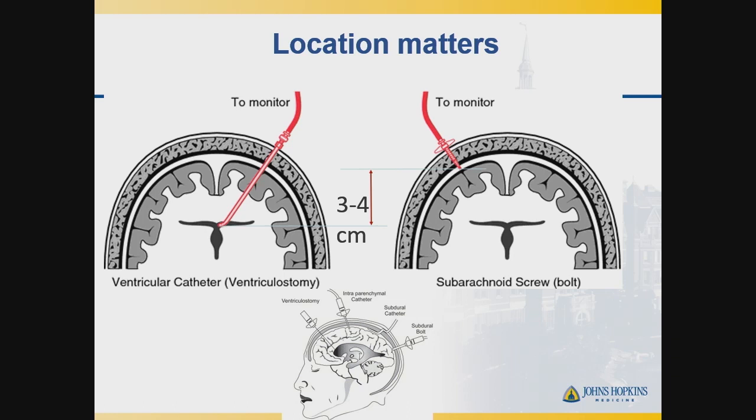This difference in height doesn't matter if you're lying flat, right? Because it's at the same level. But when you're upright, that 3 to 4 centimeters actually matters. And that's created some confusion in the literature when these different pressures are presented in the upright position.